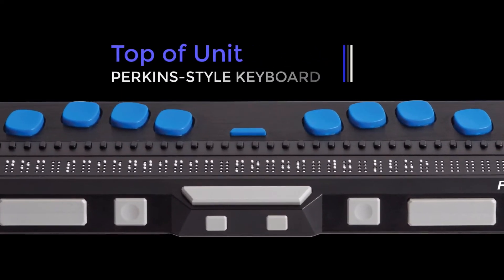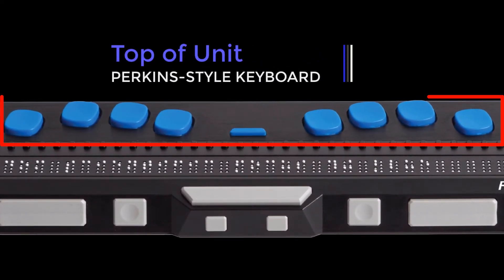Positioned above the cursor router buttons are eight keys like those of a traditional Perkins-style braille keyboard. These keys can be used to enter text or perform commands.